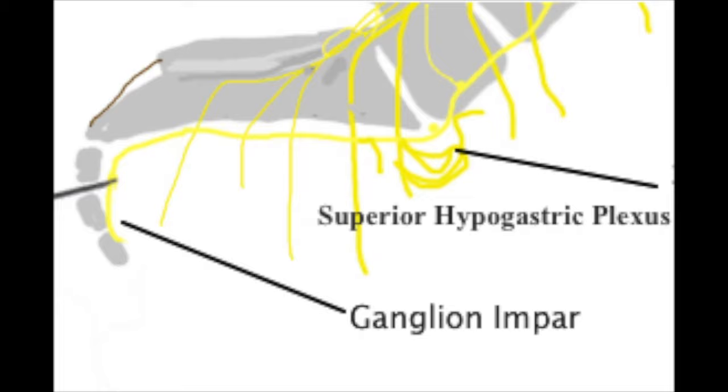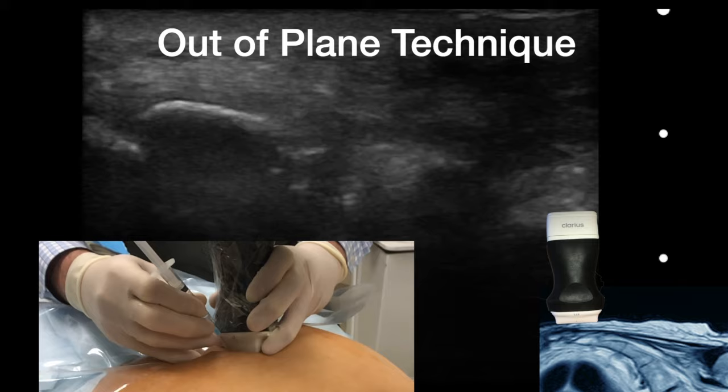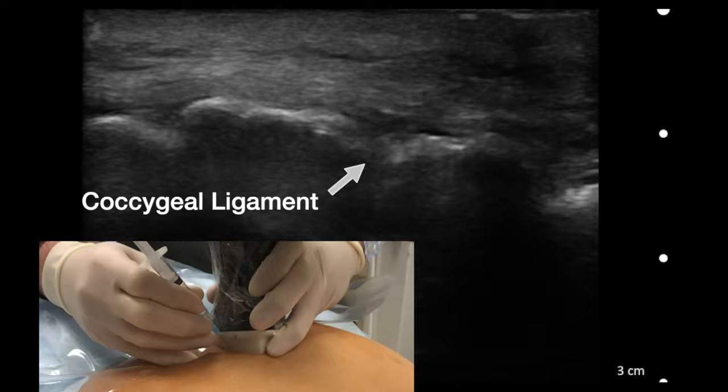You visualize in the longitudinal view the coccygeal ligament between the coccygeal bones. The target is anterior to the coccyx and posterior to the rectum.